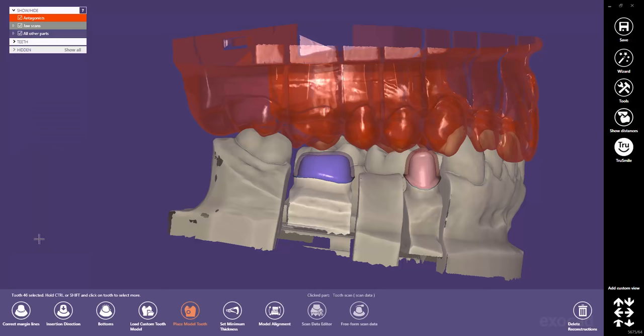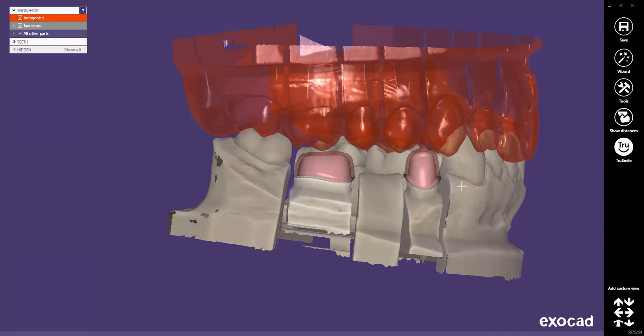That's it. You can restart the wizard very easily by clicking on the wizard button in the right frame.